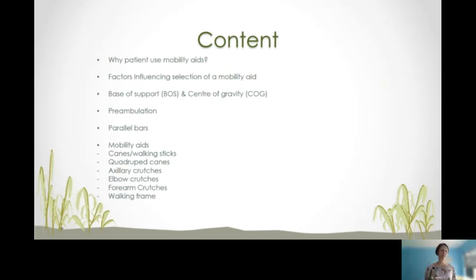That may mean that you will have to move your patient in a wheelchair to the gym in a hospital or a care center where the parallel bar is. Some wards have them in a rehabilitation ward as well. Depends on the setting that you are in. But very useful, parallel bars give support for walking again before moving on to the mobility aid.